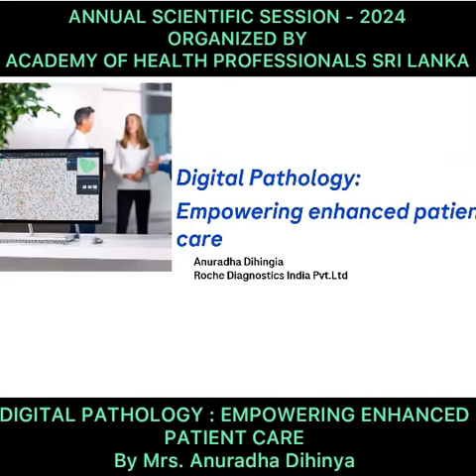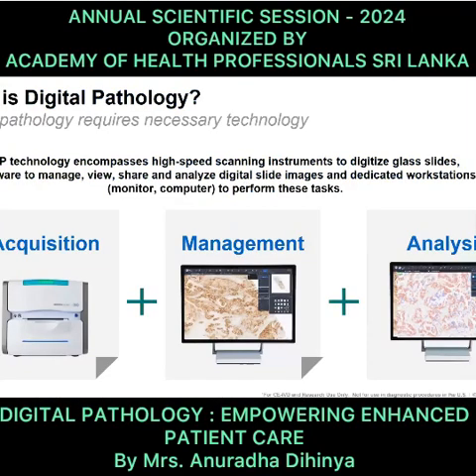Today evening, I would be discussing digital pathology and what AI algorithms are bringing in the histopathology segment and into the cytopathology area. So what is digital pathology all about and what is the buzz going on around it?